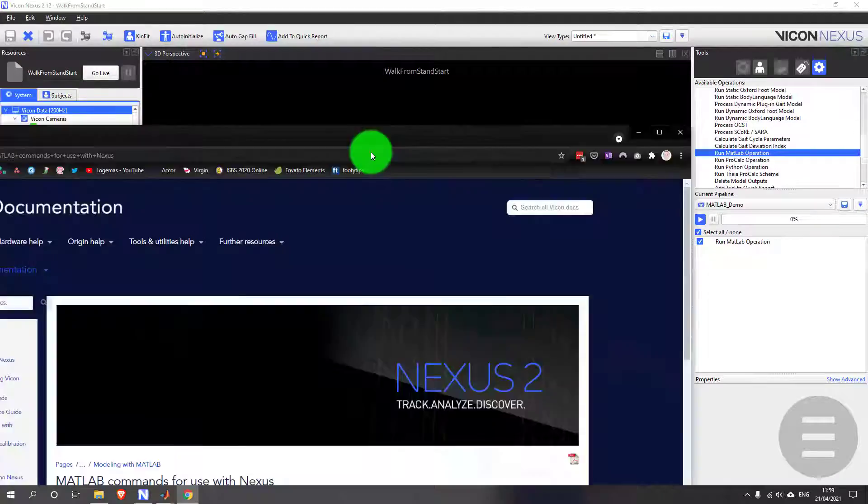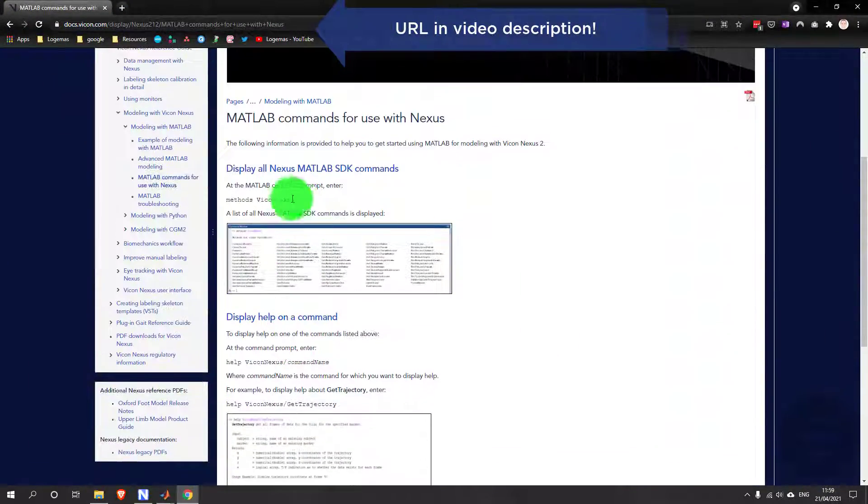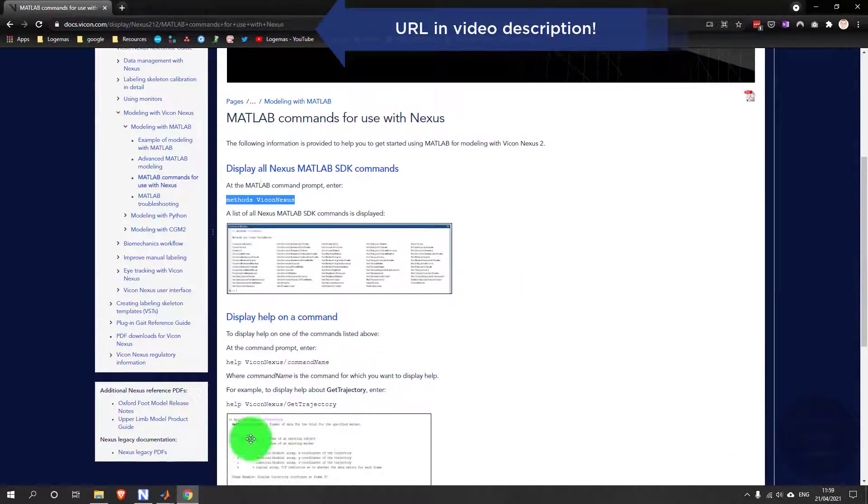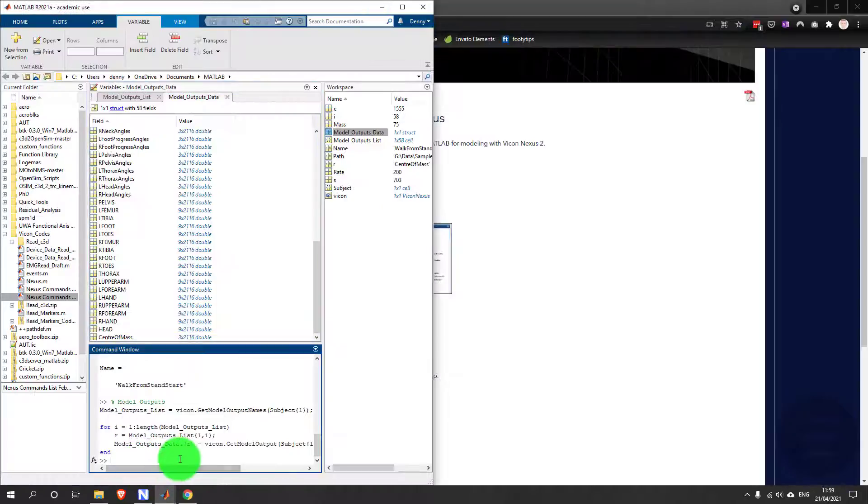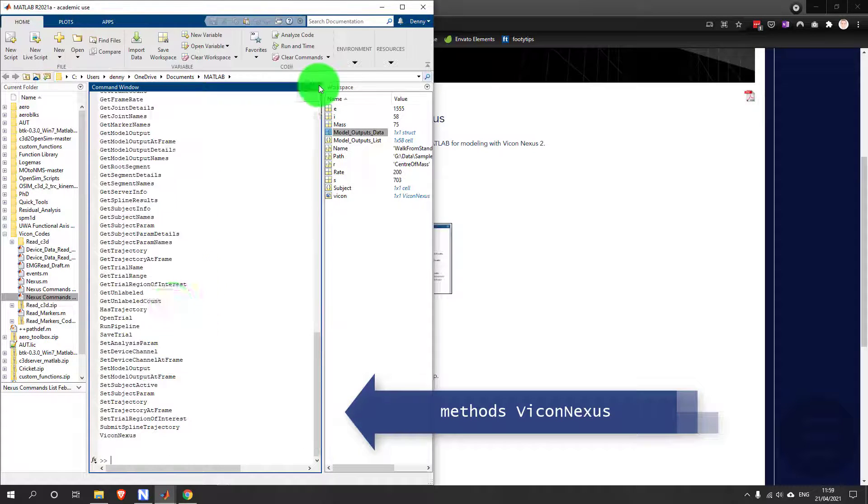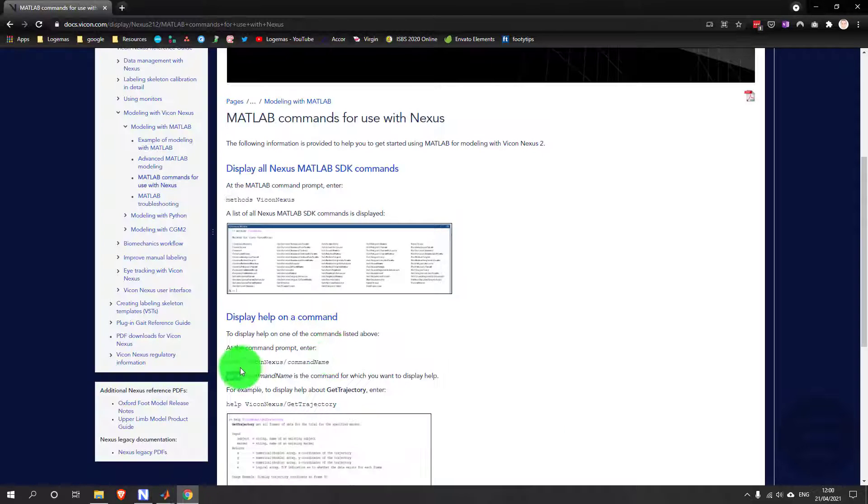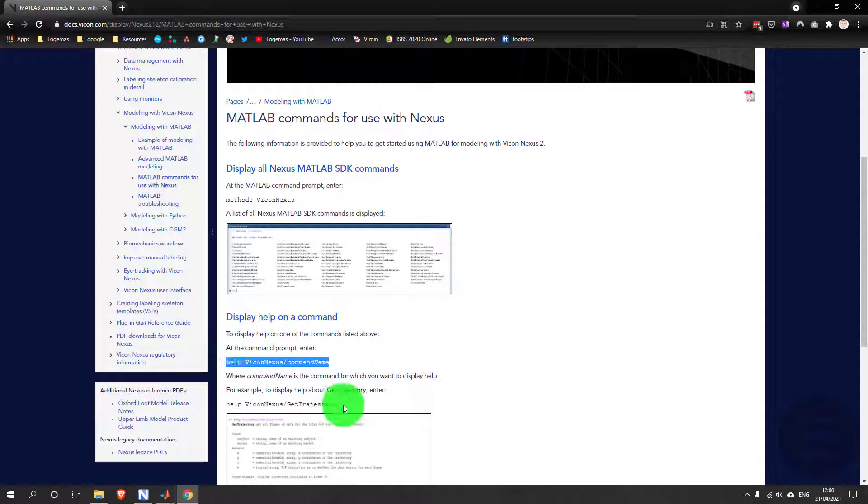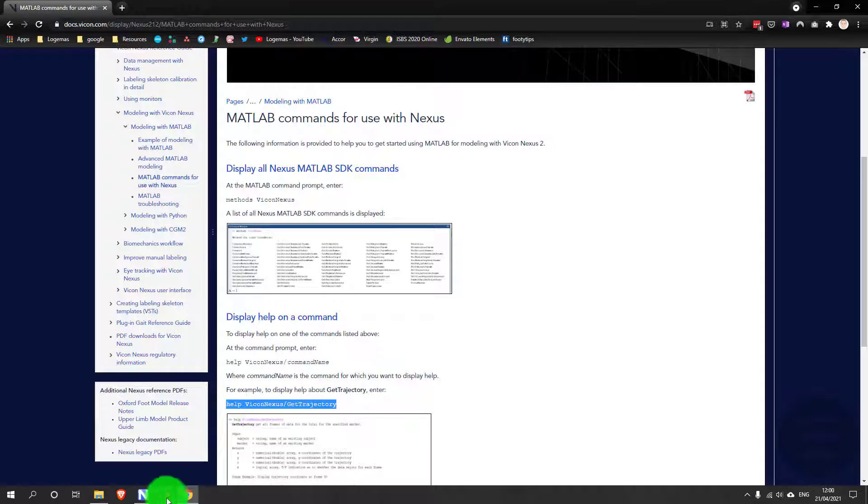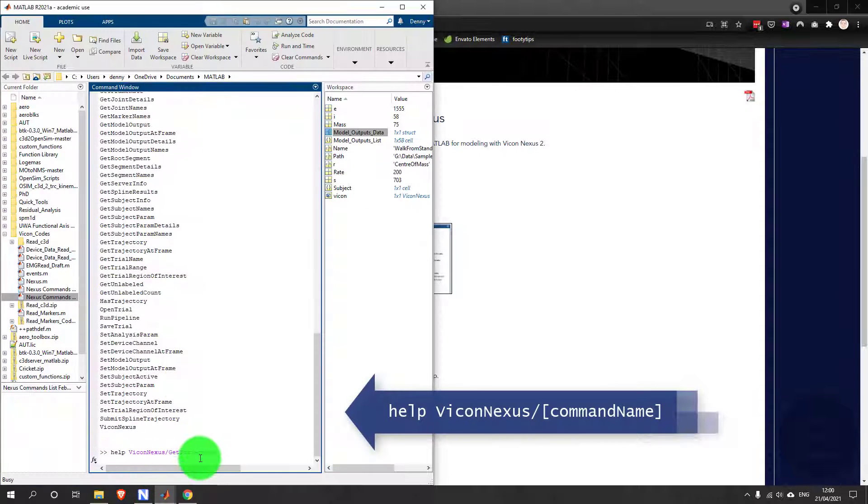Now the online documentation has more information, including some useful MATLAB tips like this one which shows you all of the operations available, and also how to get the help documentation for any of those operations.